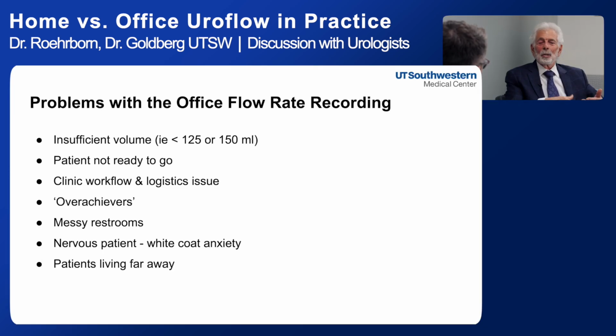I think there's a number of issues with it. The first is studies have shown 50% of the time a man doesn't have a volume of at least 150 cc's when he goes, so technically it's not accurate. Many men aren't ready to go. Maybe they avoided on the way in, maybe they got stuck in traffic, or maybe they forgot they were supposed to, so they tie up the waiting room, they tie up the exam room. Certainly with a recent pandemic, you don't want men hanging around the office, so you have a lot of men who aren't ready to do flows.